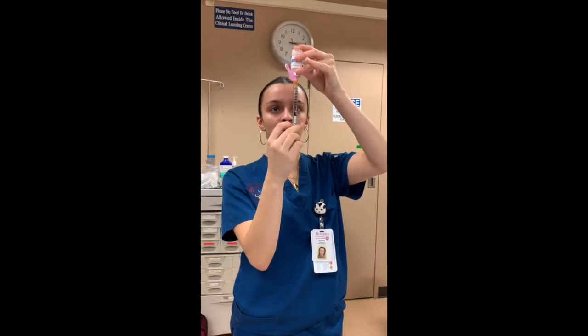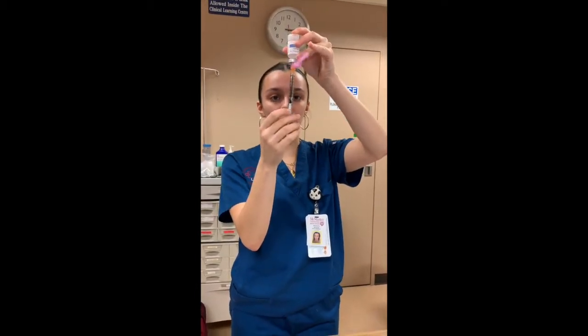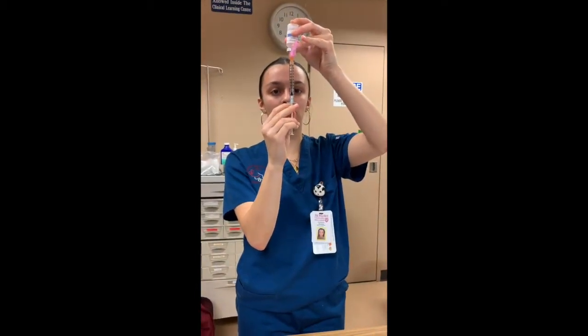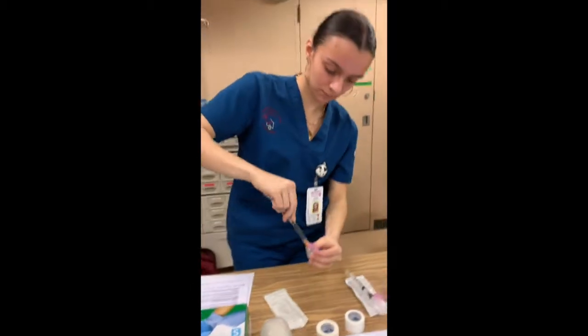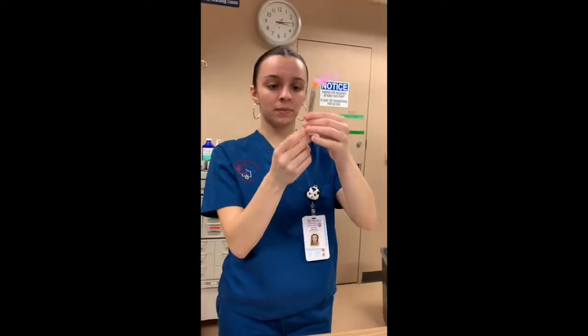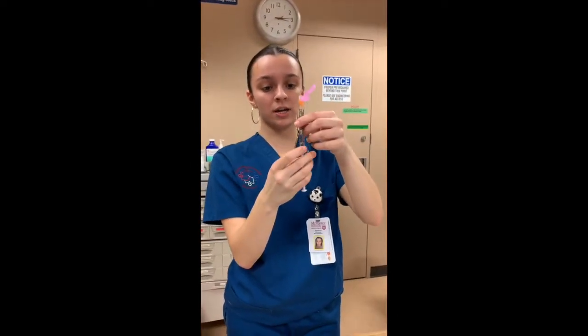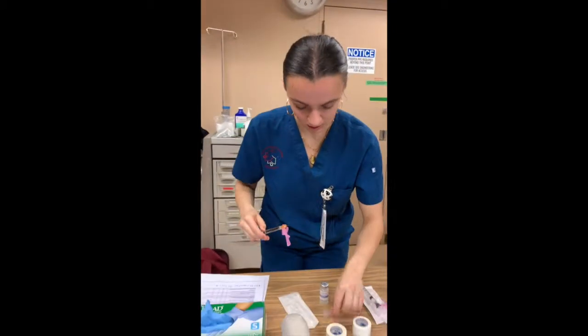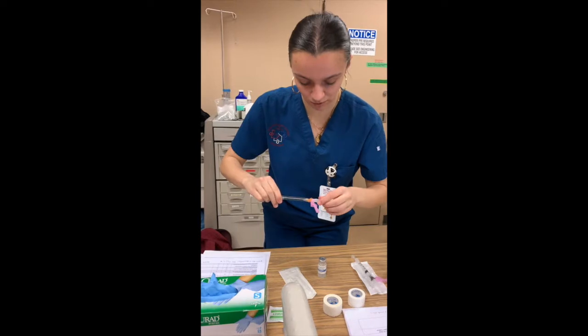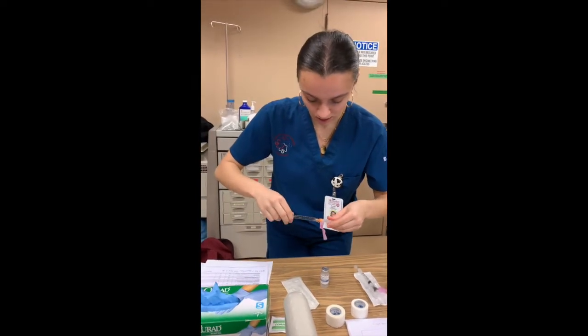Okay, and I'm just going to be giving a little more just because I'm going to be trying to get rid of the air bubbles. Okay. And what am I going to be doing? I'm just going to give it a quick flick just to get any air bubbles out. Okay, now I'm just going to be putting the cap back on just for safety and precautions.